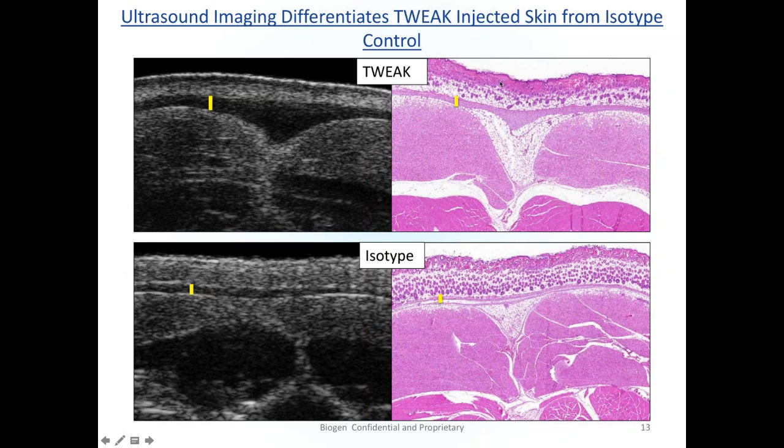because previously the team had been very interested in epidermal and dermal changes, and you may appreciate here, and you might see on some later slides, there's a much pinker area up here. There's actually a lot of inflammation going on up in the epidermis and dermis. So this had been characterized, and this portion of the tissue had been dissected and well analyzed and characterized, but it hadn't really been appreciated that there was this additional anatomical feature that was going on in this model. So ultrasound sort of shed light on things that may not have been appreciated before.